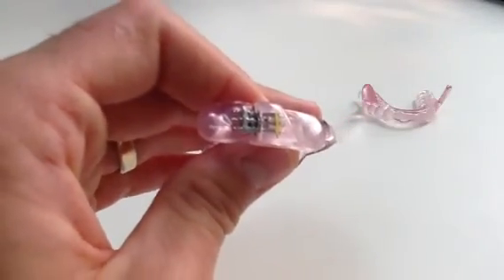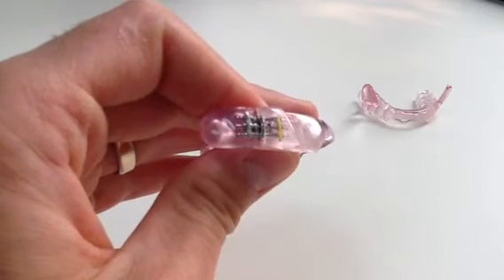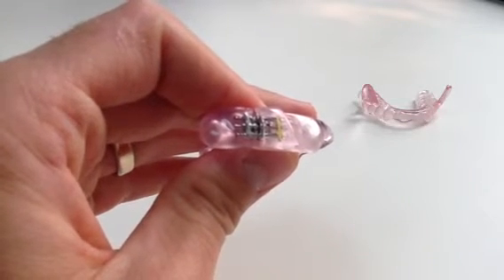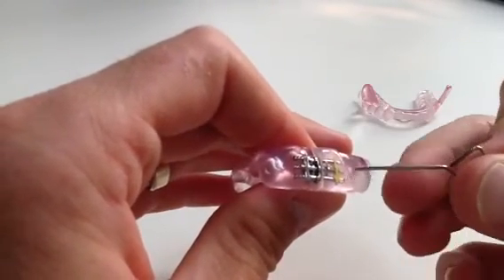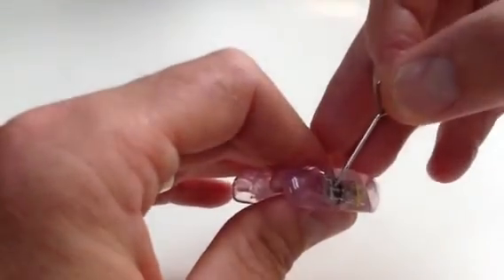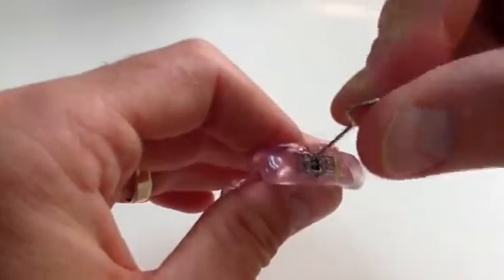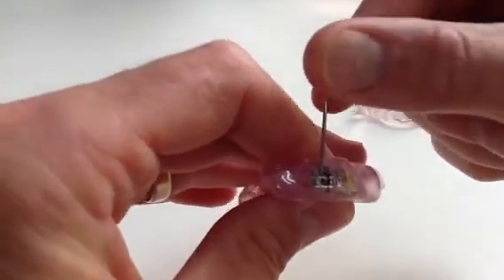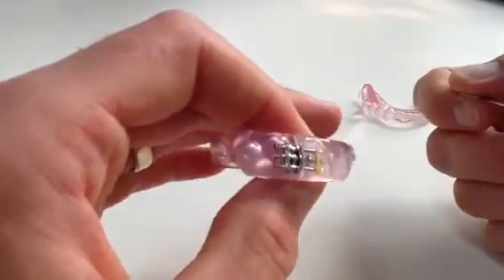Now there are cases — most cases will be titrated forward. Sometimes it is necessary to titrate backwards. In order to do that, just move the appliance backwards, going against the arrow. Turning the key towards the arrow will move it down; moving it back against the arrow will move the appliance backwards.